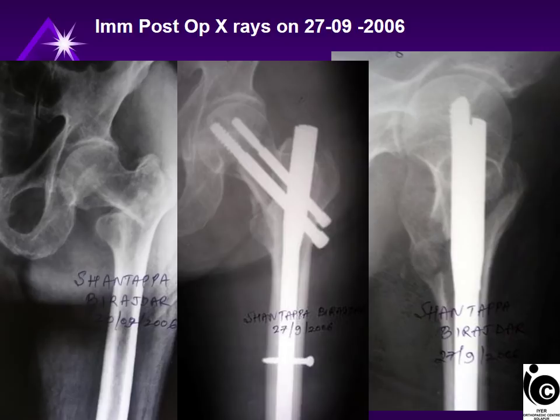If you can do that well, very good. But it is difficult to put two screws in the neck. It requires a little more extra effort. So people shift to single screw systems like the ZNN or the PFNA2, where it is a little easier for the surgeon.